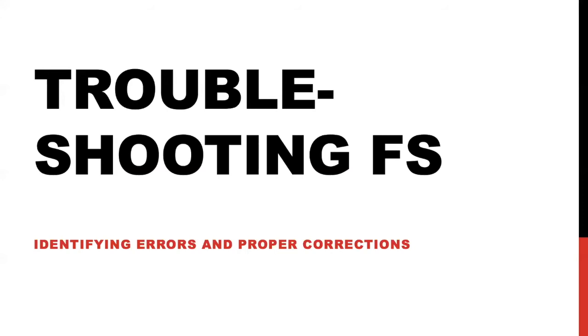Thank you, Dev. So for the second part of this presentation, I'm going to go over some of the common errors that you may find after you have run recon-all. Although FreeSurfer is a very powerful software, it still makes some mistakes. Dev, can you change the slide, please?